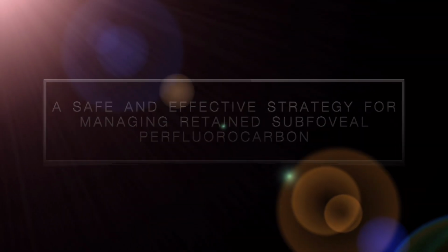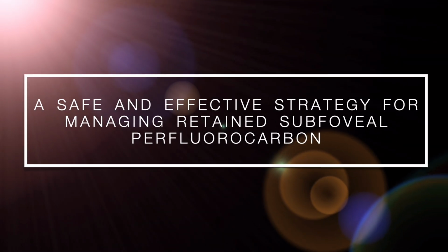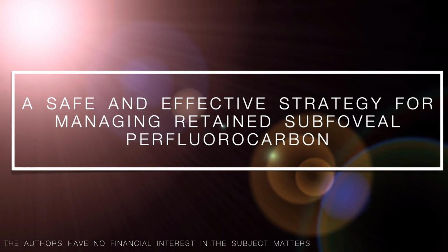A safe and effective strategy for managing retained subfoveal perfluorocarbon.